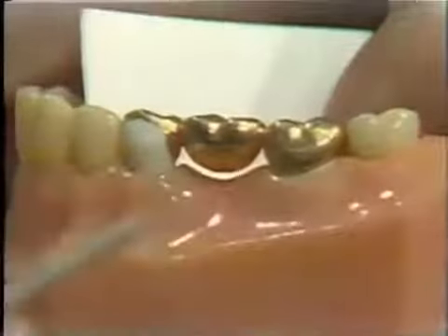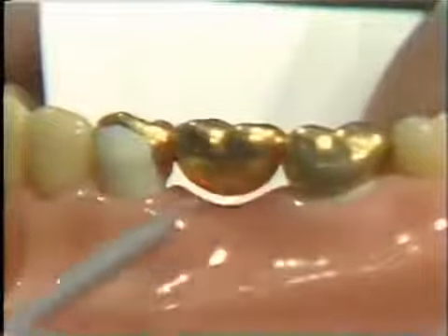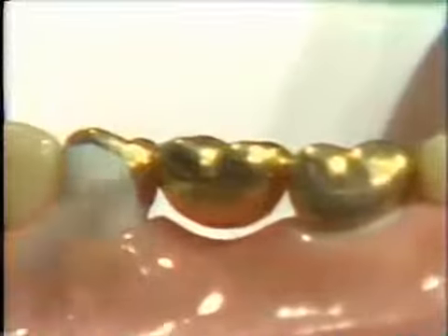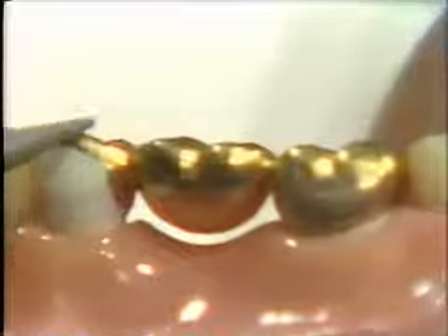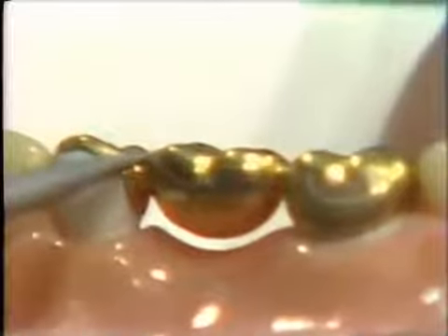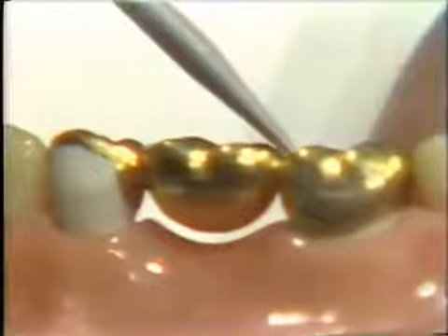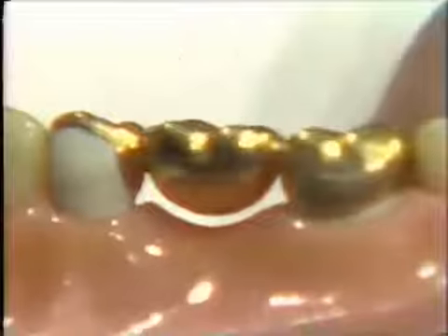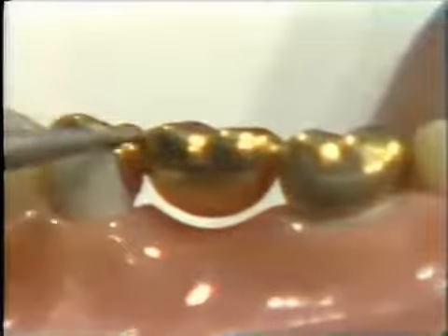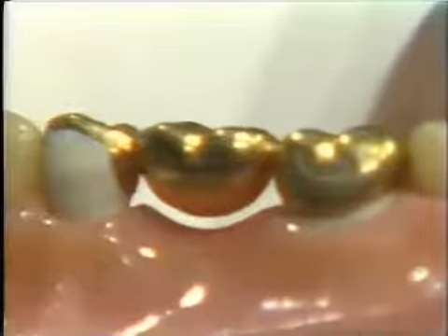You can see the opening of the embrasures on the distal here and on the mesial here. And on the occlusal surface, you can see the development of the marginal ridges dropping down to the contact point and the connector on the mesial here, and the same thing on the distal, the marginal ridge dropping down to the contact point and the connector between the 2 Pontics here. The embrasures on the buccal surface here, you can see have been well rounded and are highly polished. But this type of Pontic serves well in the posterior region where aesthetics are not critical.